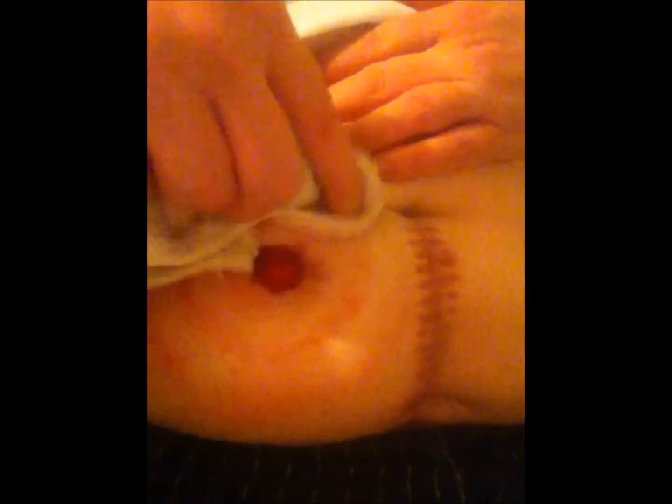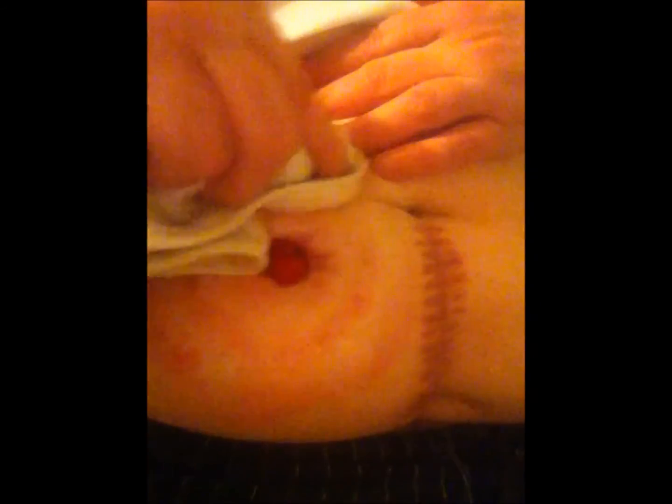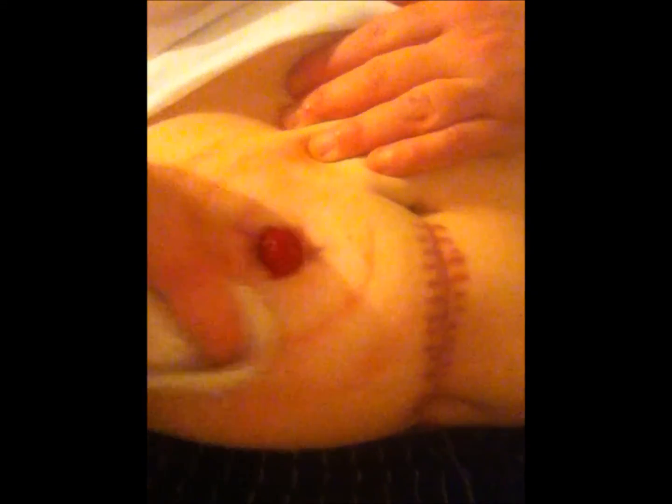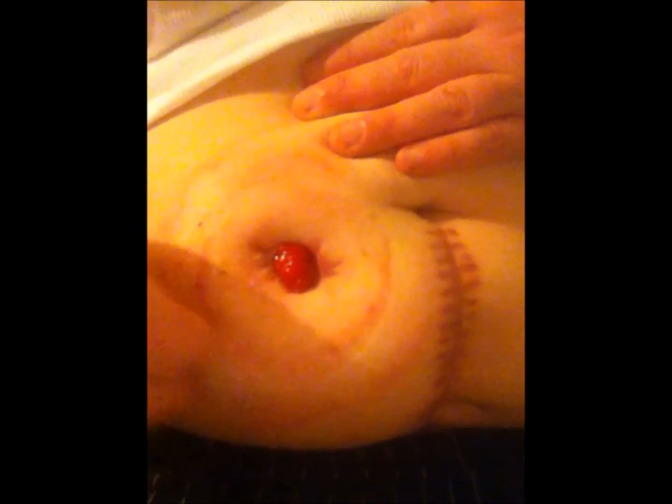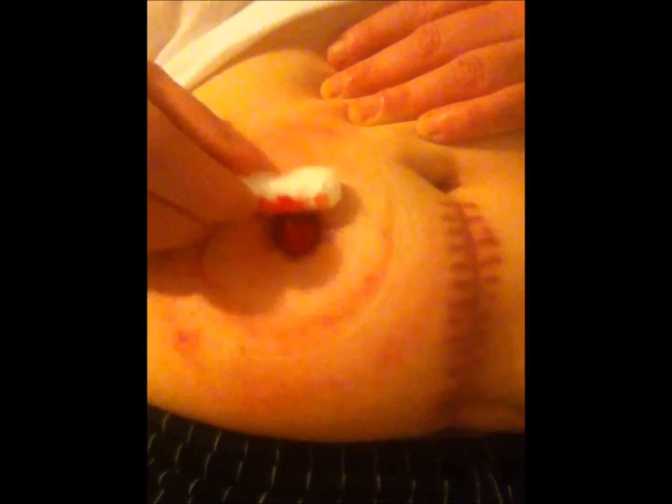I have to put my wafer on once every 5 days, sooner sometimes rather than later. And I have to change my urinary pouch every 2 to 3 days to keep it clean, because I don't want the bacteria going back into my kidneys, and your intestines do tend to hold on to bacteria. That's what it's designed to do. So I know it looks awful, but my husband loves me and I'm alive.